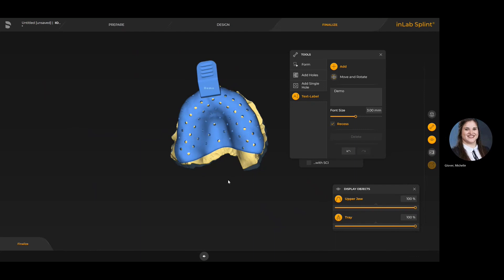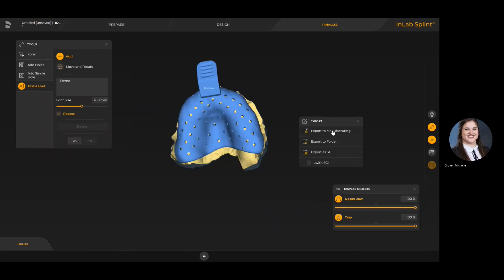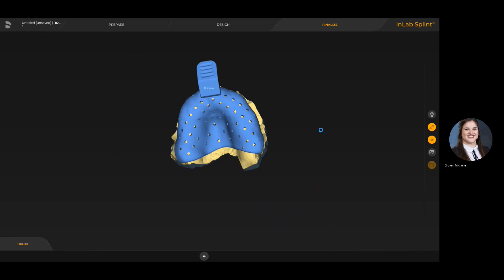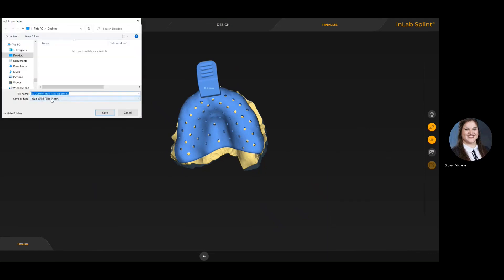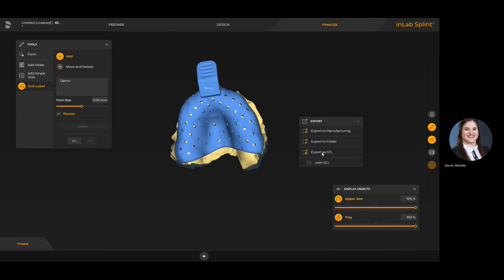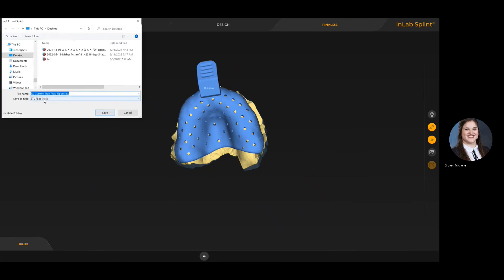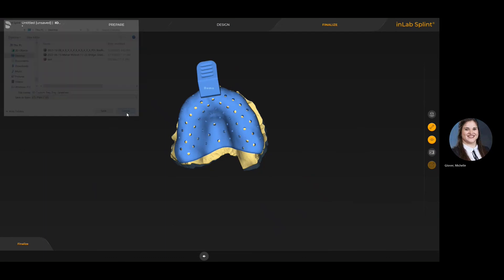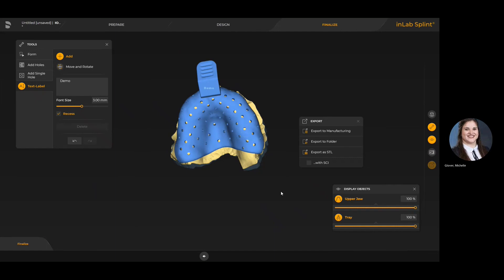Another thing people often do at this point is add a text label, often to the handle, by double clicking to place it. Then you can export to manufacturing — which connects to in-lab CAM software for something like Prime Print — or export to STL. If you are exporting to STL, just make sure you know where you're defining the path. And that has been the custom tray workflow in in-lab 22.